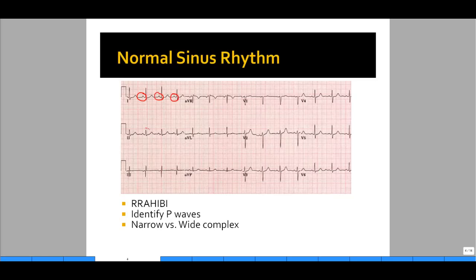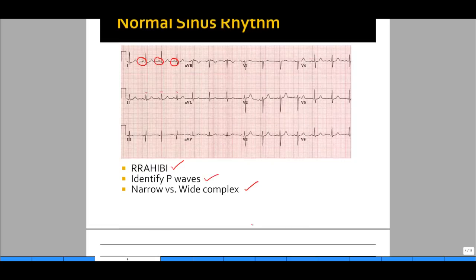Always for normal sinus rhythm, look at the P waves first. Identify if there's a P wave for every QRS. If there is, then look at the QRS — is it narrow or wide? Both criteria will automatically identify that the rhythm is originating in the atria. In this case, we have a P wave before each QRS and a narrow complex QRS. Thus, we know this is normal sinus rhythm. The rate is not elevated, not tachycardic, and not bradycardic. This is a relatively normal EKG.